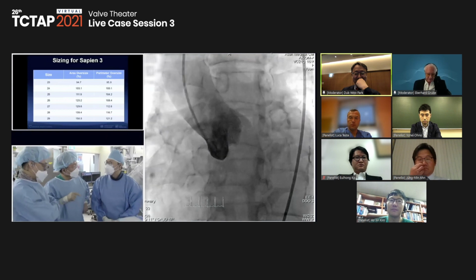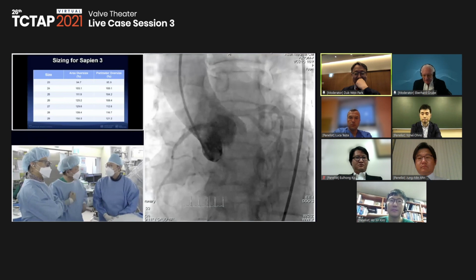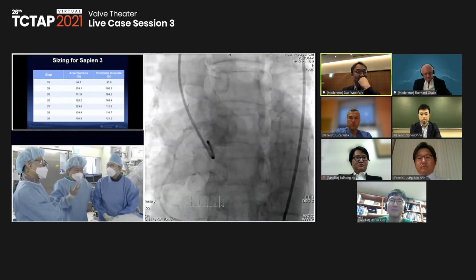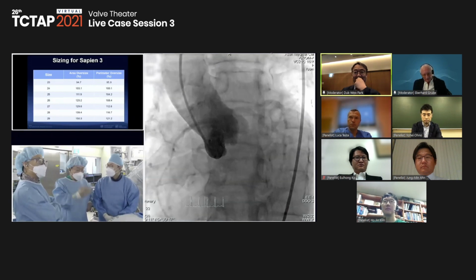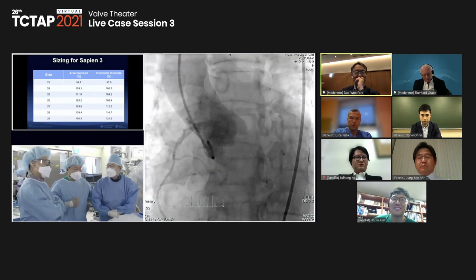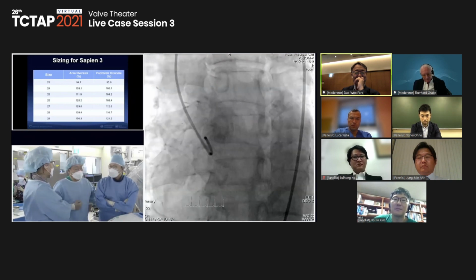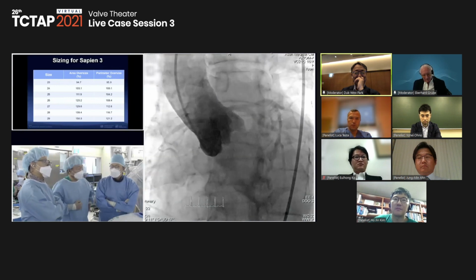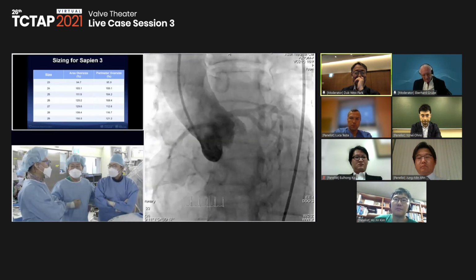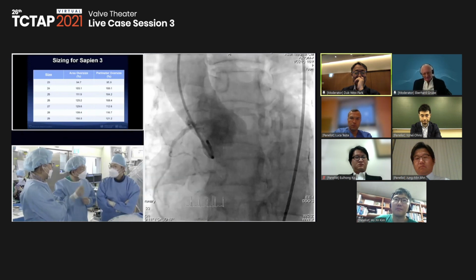around 65 years, maybe before and after. And from the internist side, we can do TAVR, right? Anyway, it's the same kind of tissue valve, even with open heart surgery, and the only concern was actually longevity, right? However, lots of things can be solved. And we have very small differences of opinion.